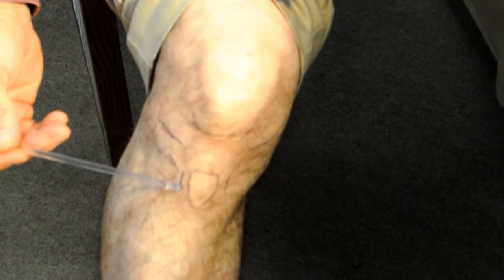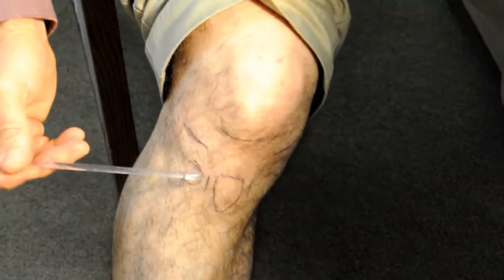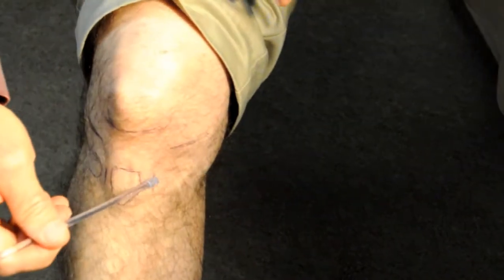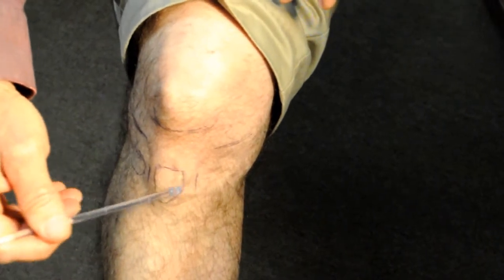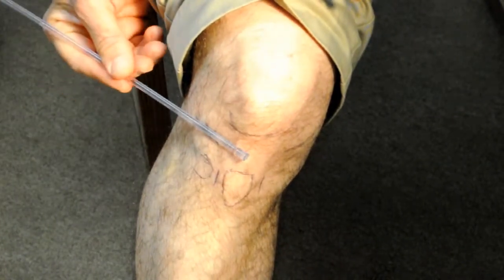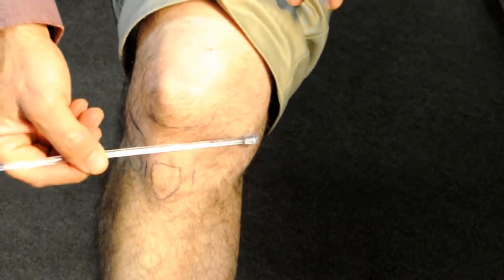The incisions for harvesting cancellous bone from the proximal tibia can be between the tibial tubercle and Gerdy's tubercle or immediately medial to the tibial tubercle. The incision need not be made much longer than is indicated with these ink lines. Subcutaneous approaches to the proximal tibia are a very safe distance away from the joint line.